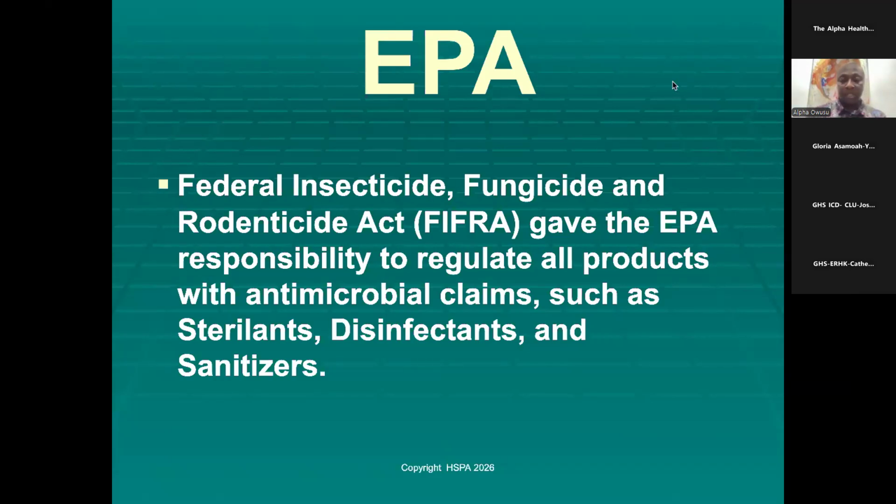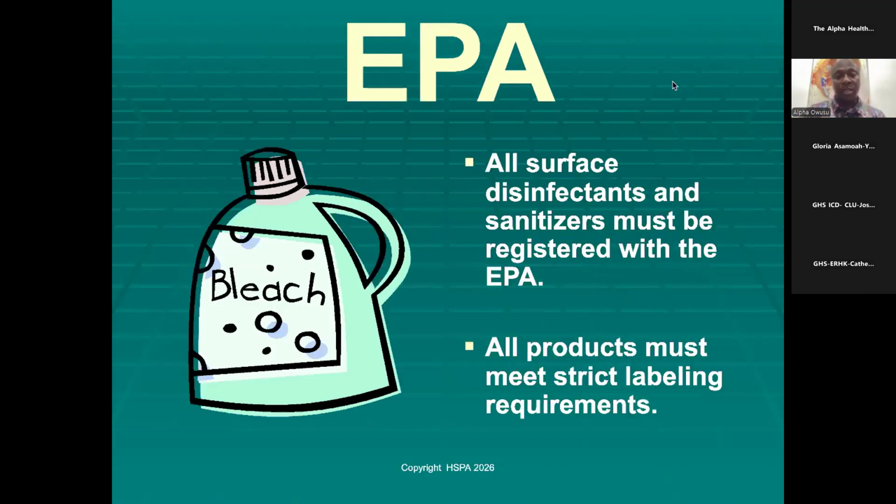Very, very important, right? We have to look at all these, the sterilizers, the sanitizers that we are using, the chlorines that we are using. And I keep mentioning that the chlorines are very strong. They open it, it's always open, right? And the technicians go there, they don't cover their noses, and they are inhaling all this aerosol. What is happening? We got to look at all these things. We have to get policies to regulate that. Very, very important, right? Very, very important.